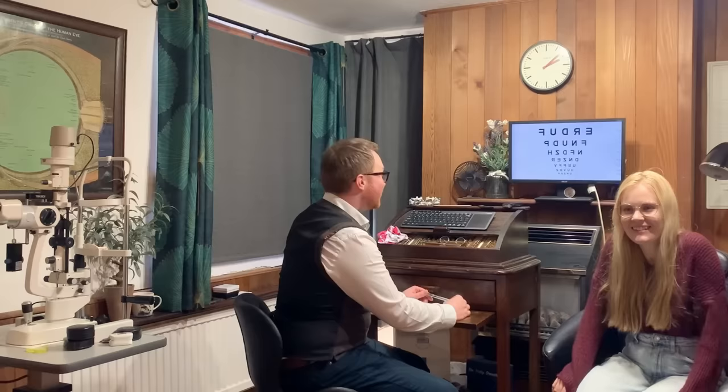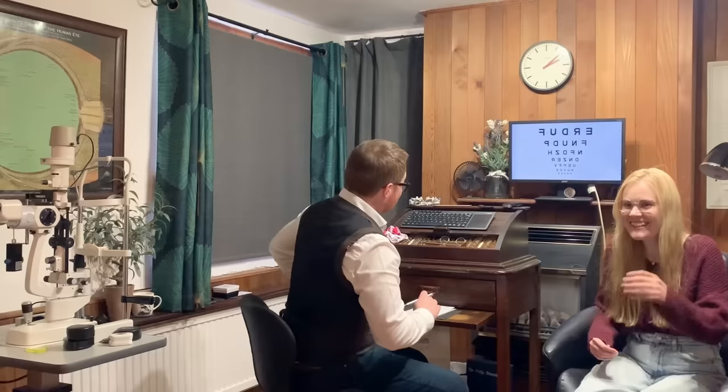That's an E, isn't it? It's an E. Yep. And either an R or a H. Very good. I mean, a little bit of leaning there, but no, 5 out of 5. Well done. Excellent. There we go.